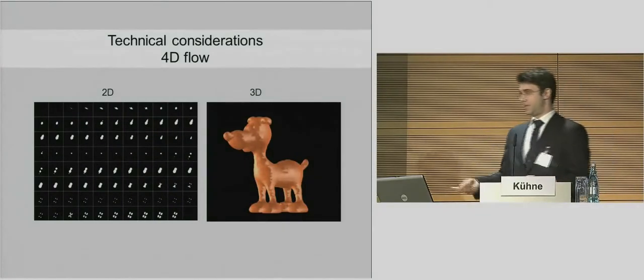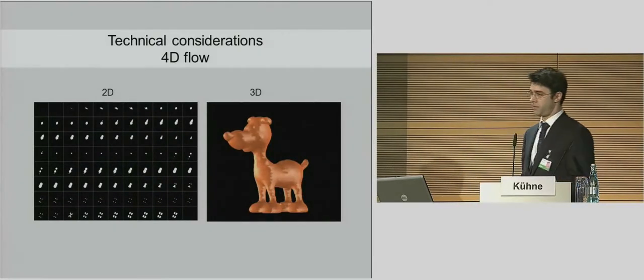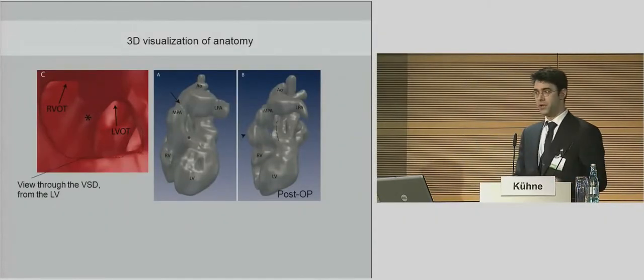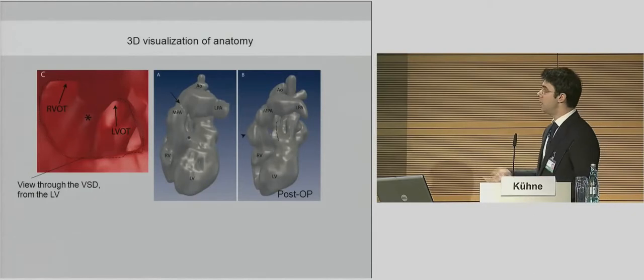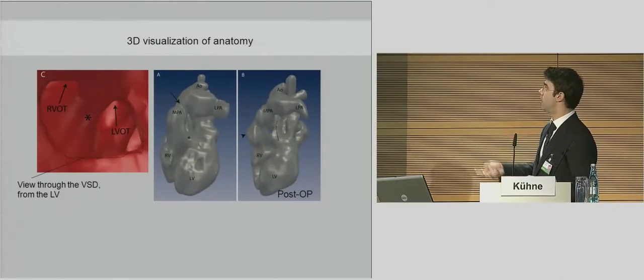And it's always fun to have the surgical discussions with our surgical colleagues, and it's interesting what visions the one has and the other one, and sometimes it's complicated to share the vision. So I think 3D definitely became more than just a tool in the assessment of complex things. I'm not going into detail here, but this is a 3D intracardiac visualization. This is the septum, right ventricle, left ventricular outflow, and we can see the blood pool pre-operative and post-operative.